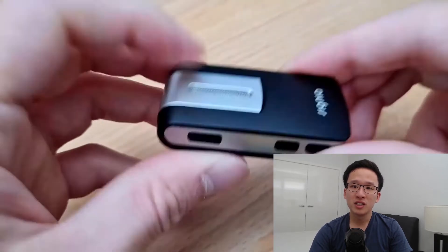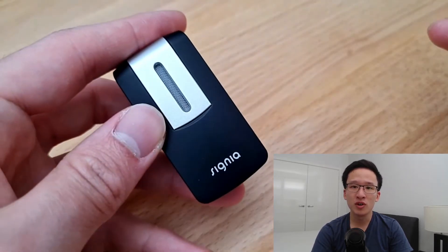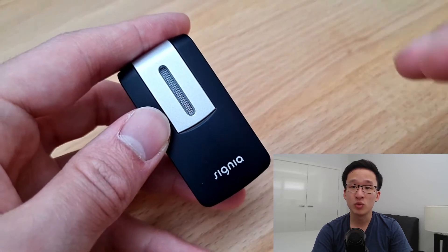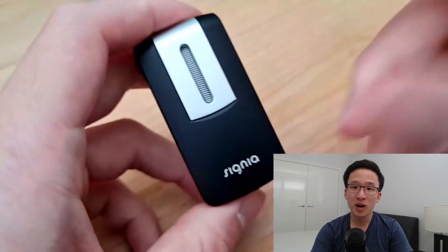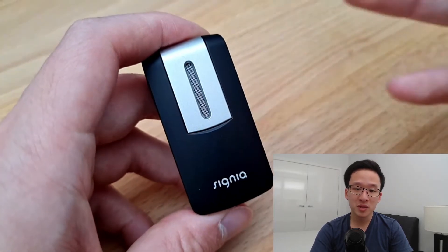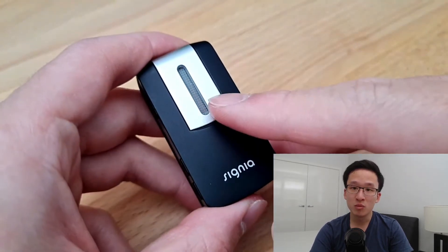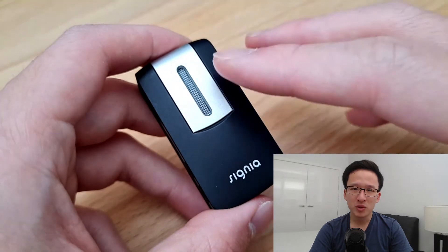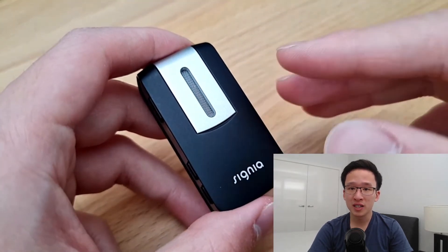The second function is using it as a remote mic. For example, if you're in a restaurant situation and it's really noisy, you would turn this on and put it on your partner across the table from you. The microphone would pick up the signal from their voice and help you hear them much more clearly. From my experience, it doesn't work that well as a remote mic — it's a bit noisy and a bit quiet at times.